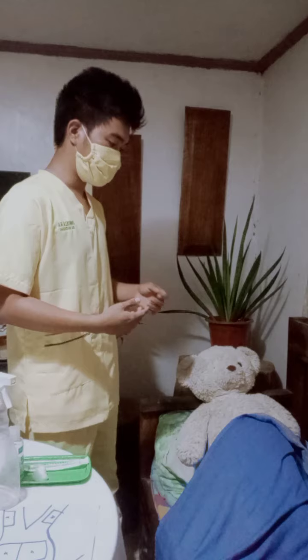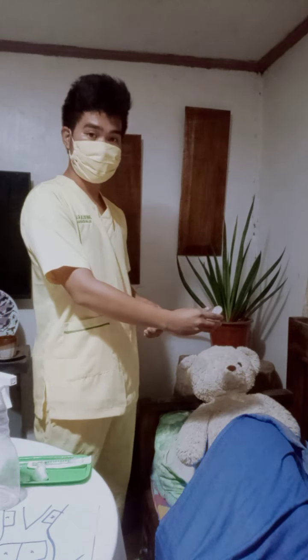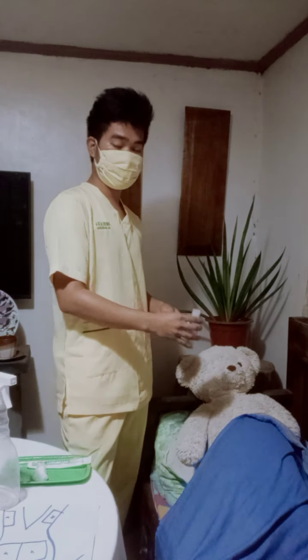After that, we're going to discuss the ordered dose of medication. It is important to explain the ordered dose of medication to our patient so that he or she has the accurate dosage of medication that he or she needs. Then have the patient check the label of the vial. We're going to check the label of the vial, give it to our patient, and let him or her check it.